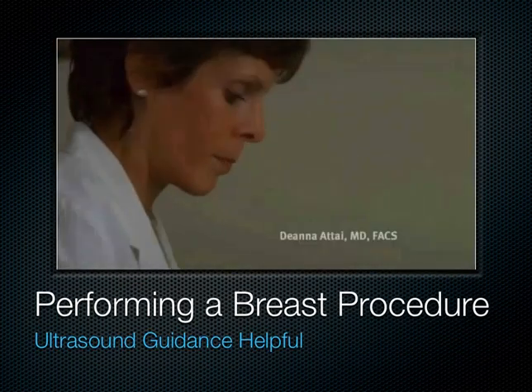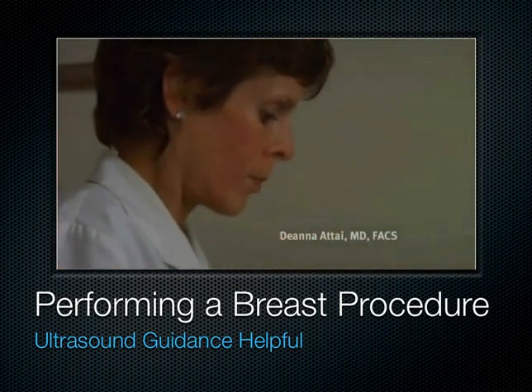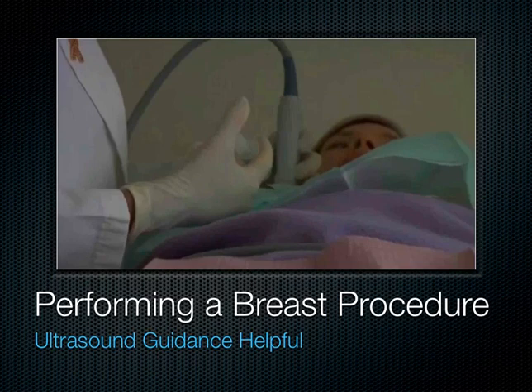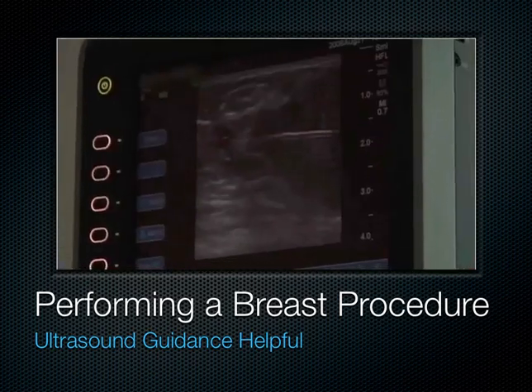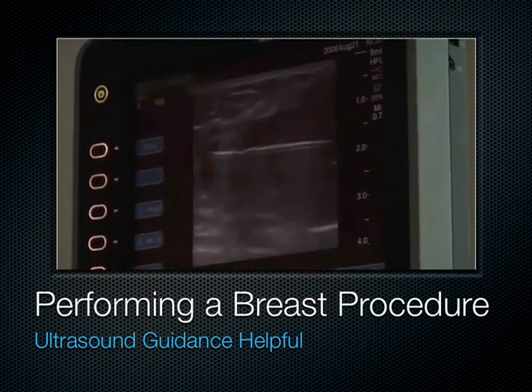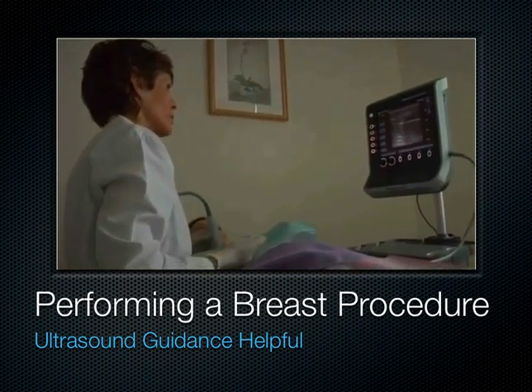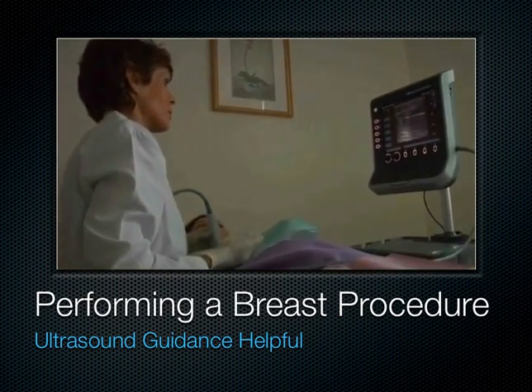Now basically what we're doing initially is just putting numbing medication in, and so we'll numb up the skin of the breast and then the underlying breast tissue. Do you feel this? A little bit. Yeah, this is on the other side of it. On and off. Okay. If you look up on the screen, you can see the fibroadenoma to the right, and then the numbing medication's gone all the way over to the back side right there.